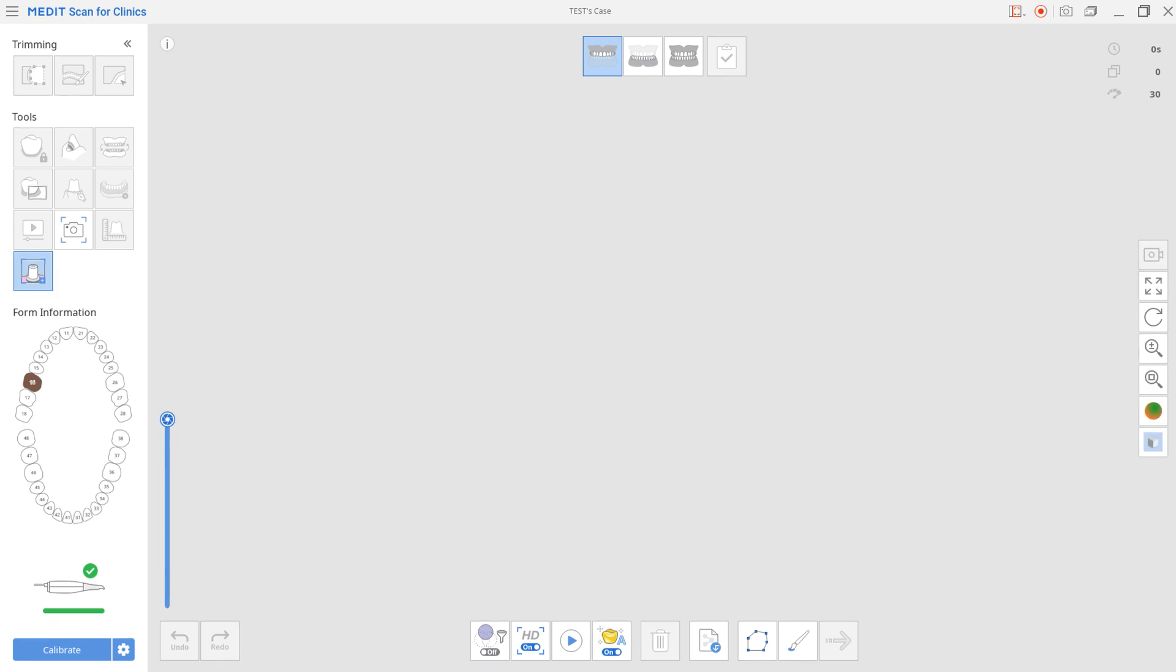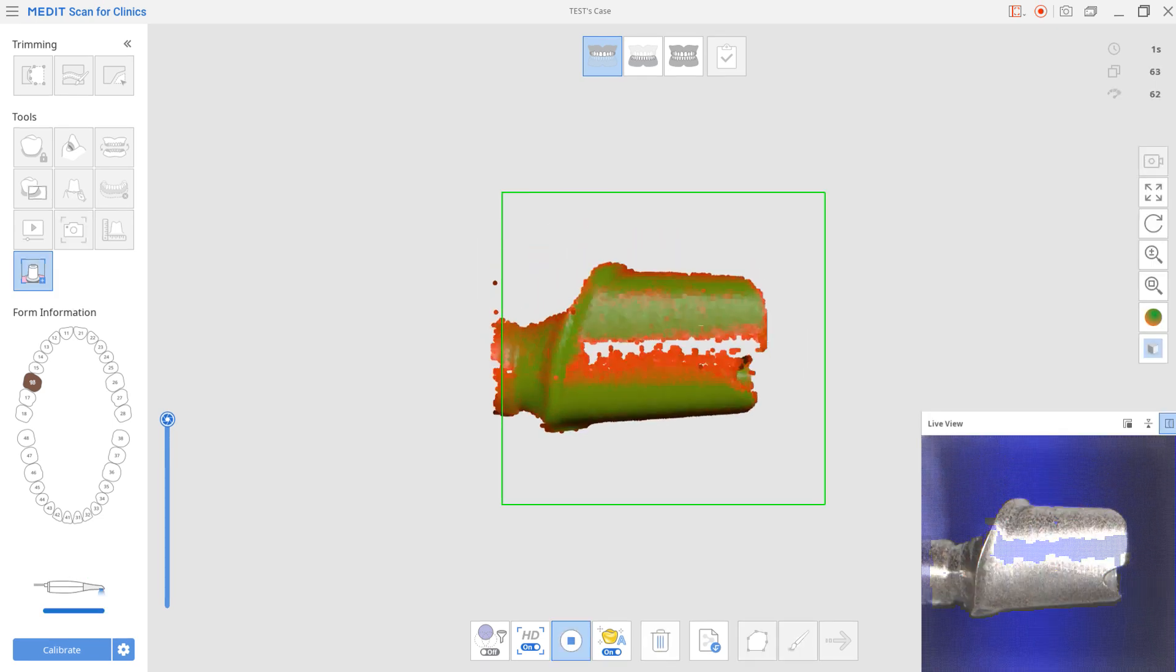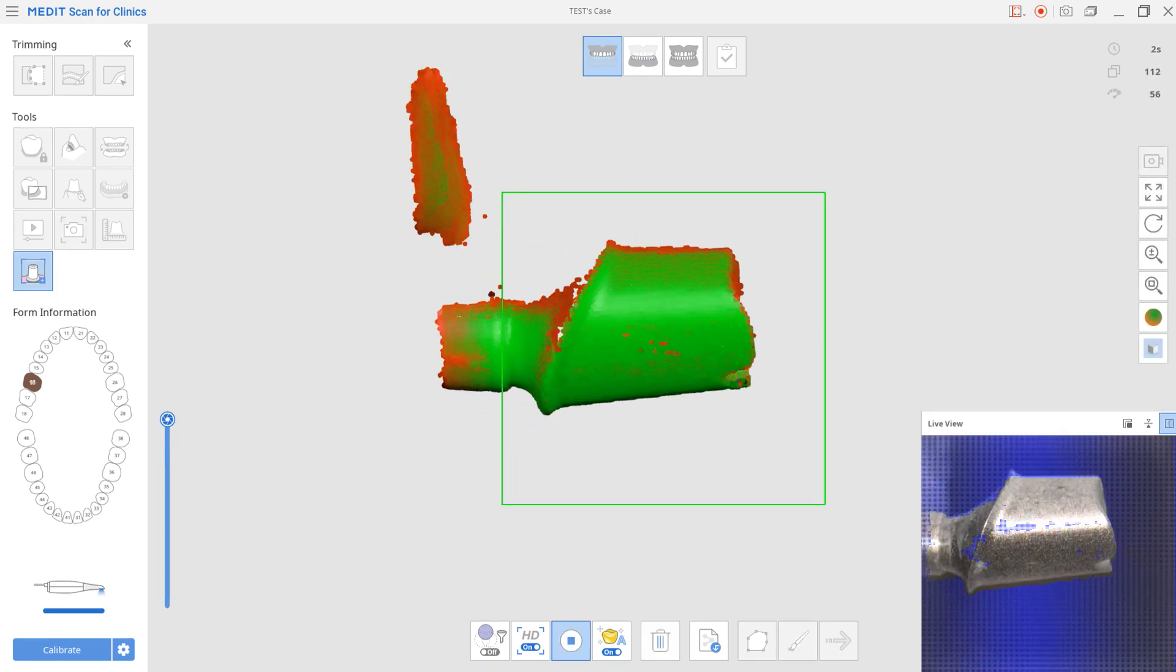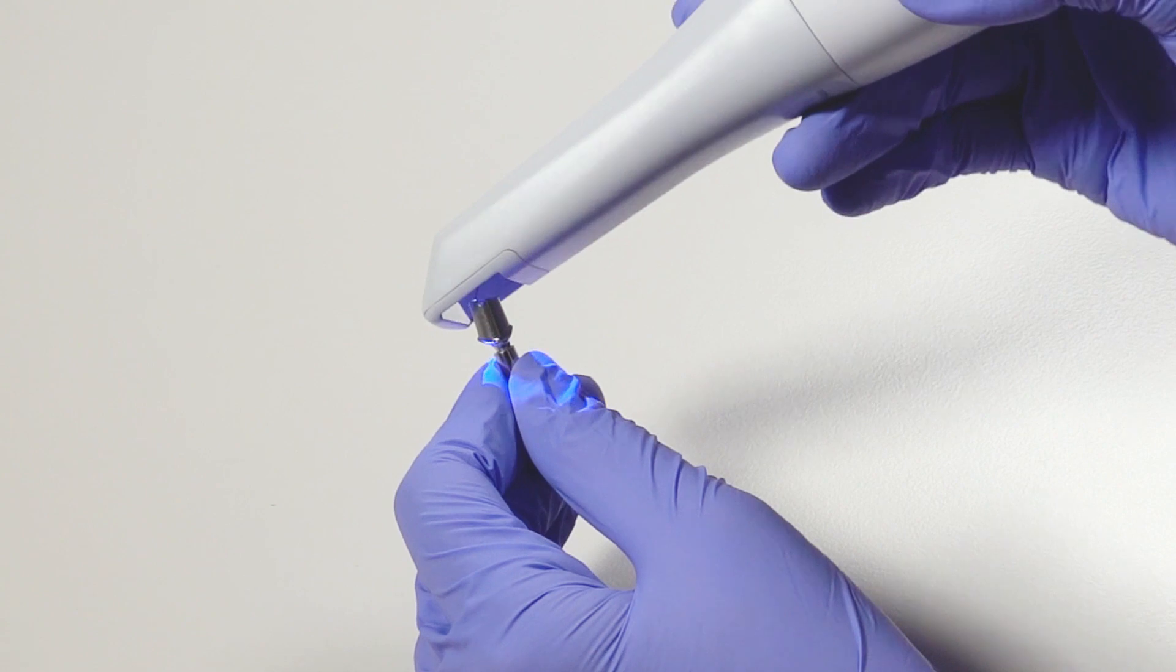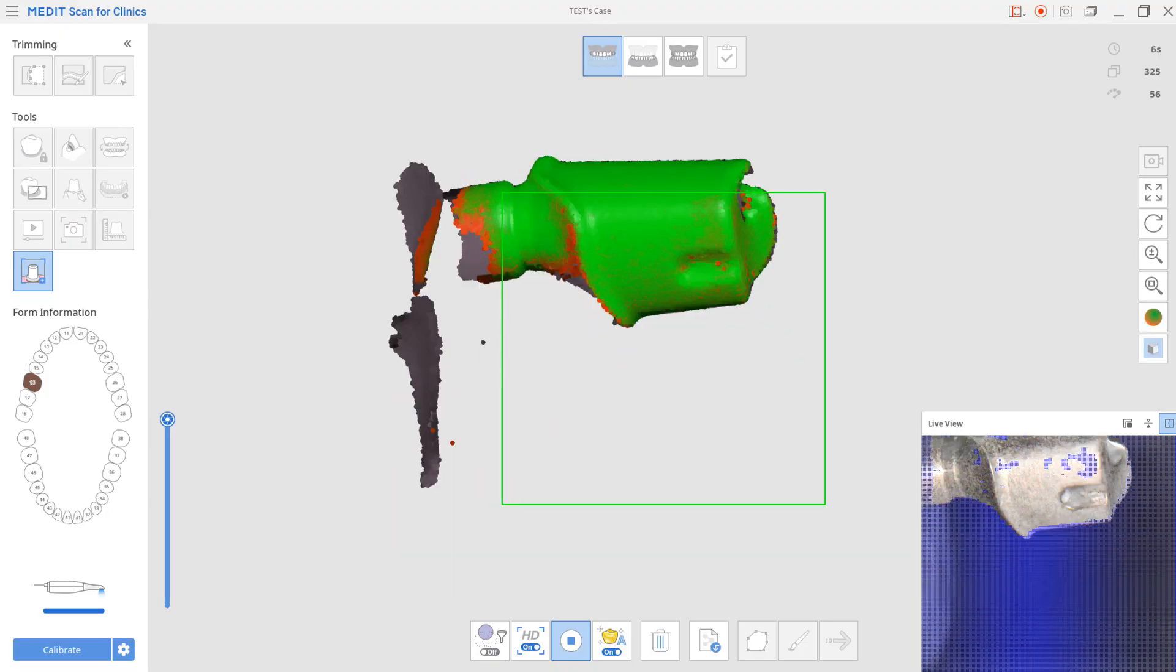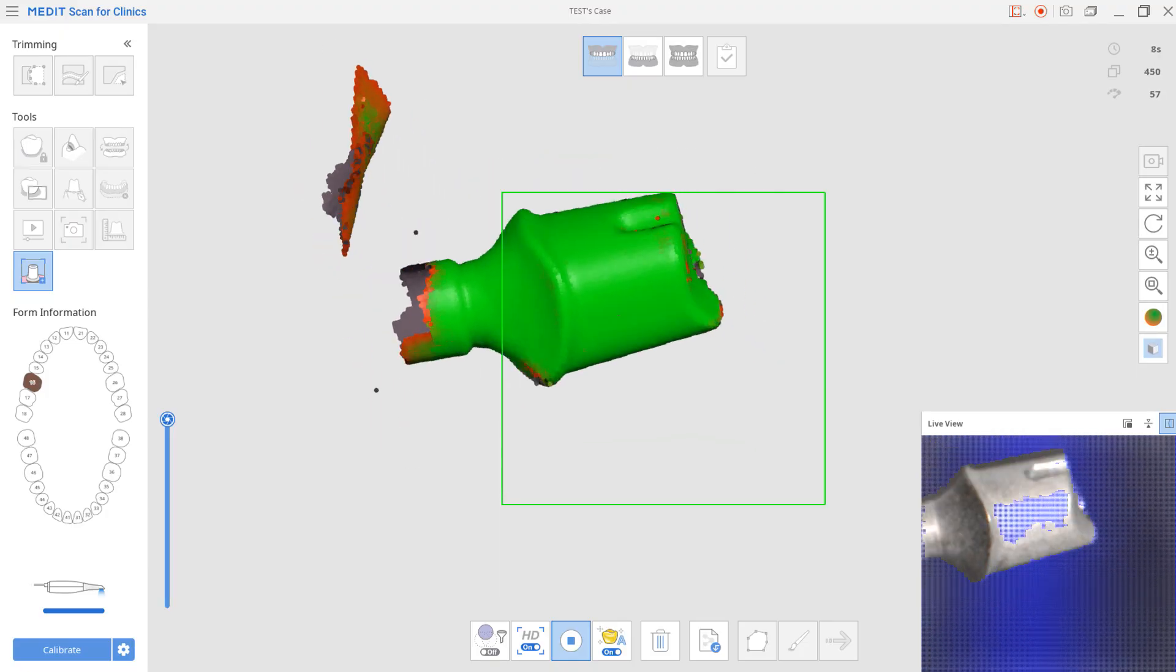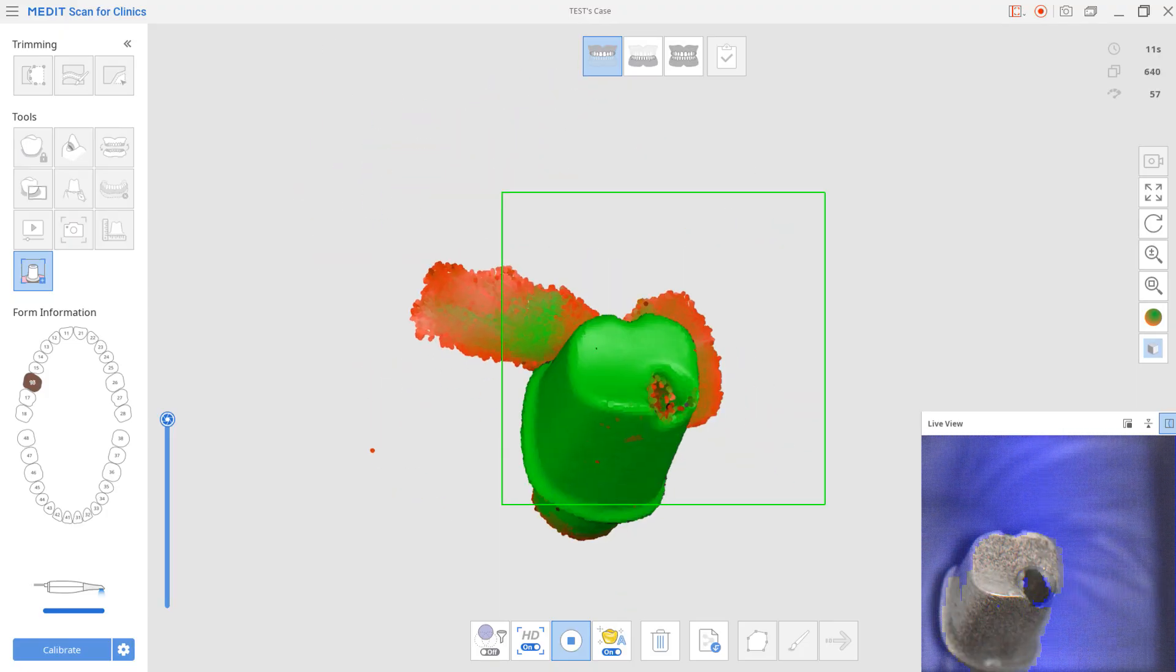First, use the scanner to scan the abutment. For an easier scan, we recommend using smart color filtering to prevent scanning your gloves.